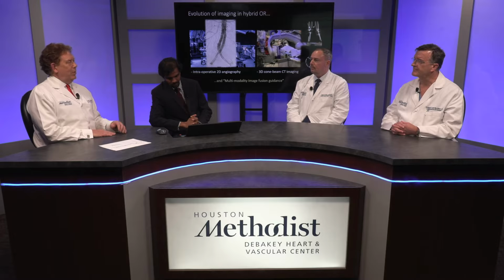One of the things, because we're obviously interested in dynamic imaging, and one of the analogies we're trying to use is, nobody will ever come to you to fix a mitral valve and show you a static image of the mitral valve, and yet for aortic dissections the standard of care is a static image of the aorta. We're trying to say that we should be applying the same kind of standards to a really complex dynamic structure like a dissection that we would when treating a heart valve. It's a functional problem, maybe not quite as much as a valve, but nevertheless.